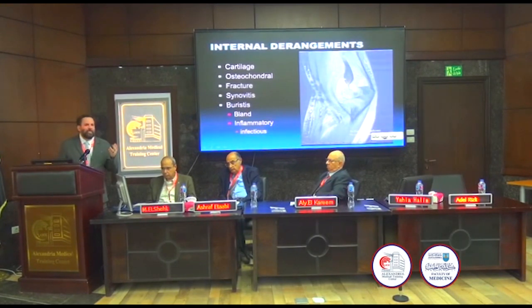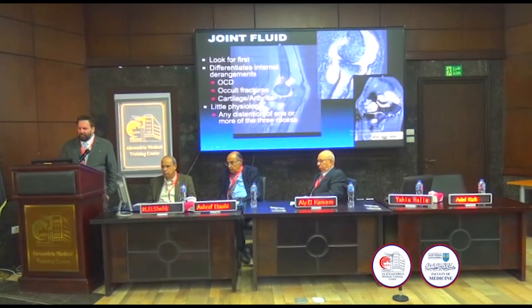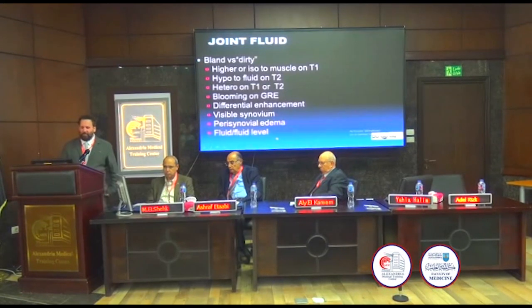So does this look clean or dirty? Dirty. So you've got to think, is this septic arthritis? And it was septic arthritis. Okay. So if we look at these patients, this is a clean effusion. This is kind of an M. Could be a little bit inflammatory. I'm not sure. And here we see synovial proliferation. I'm going to show you this case again a little bit later.